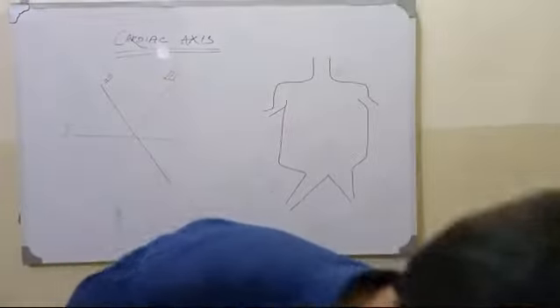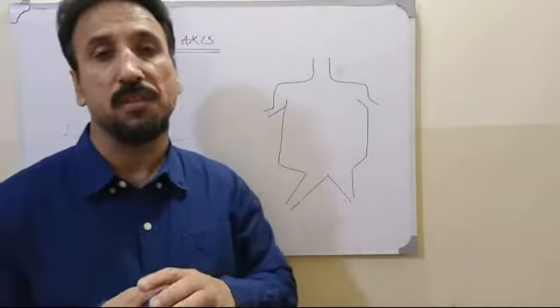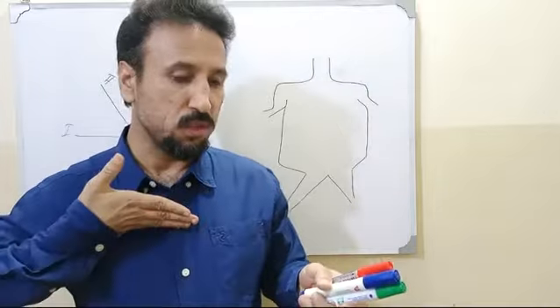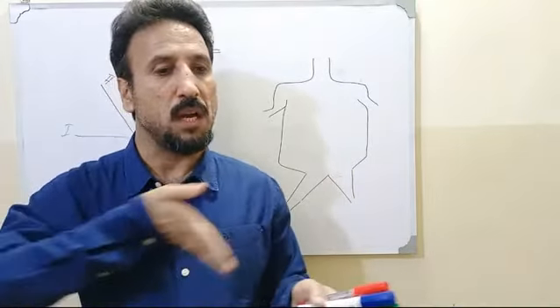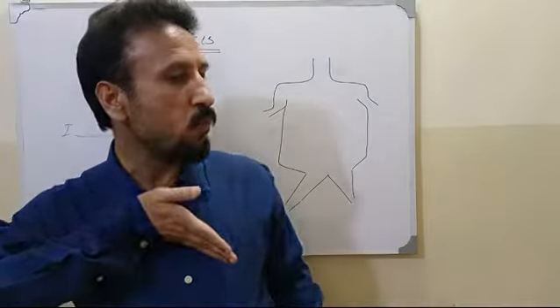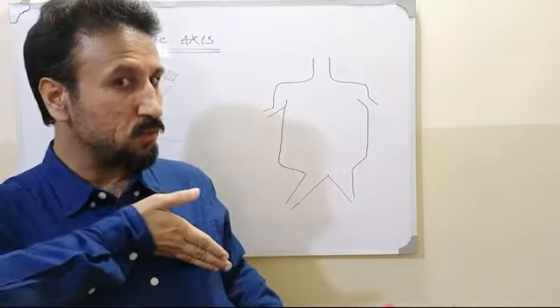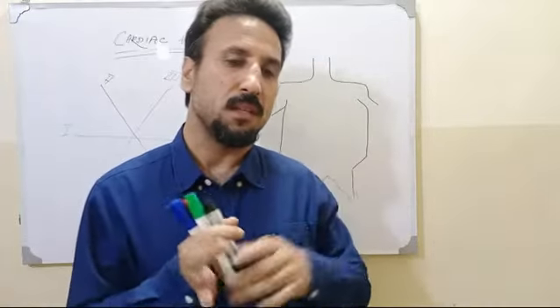The first thing which is important for the cardiac vector determination is to imagine that this cardiac vector is just like a snake which is rolling on your chest, moving from one side to the other side, changing its vector, its position and its direction, and finally making the final direction that it goes like this. So the cardiac vector is just like this.